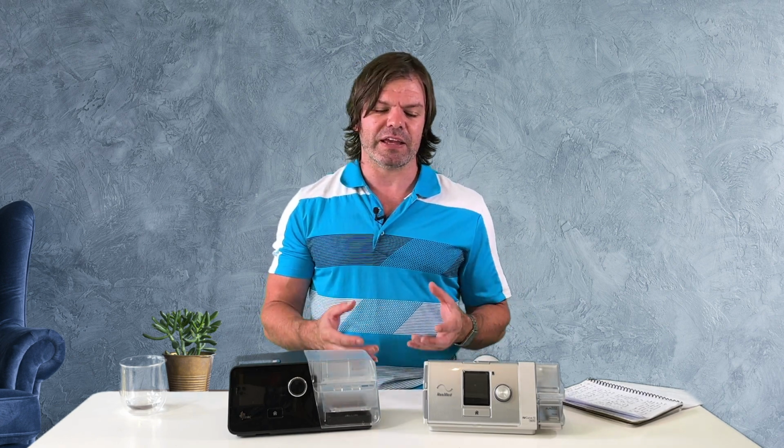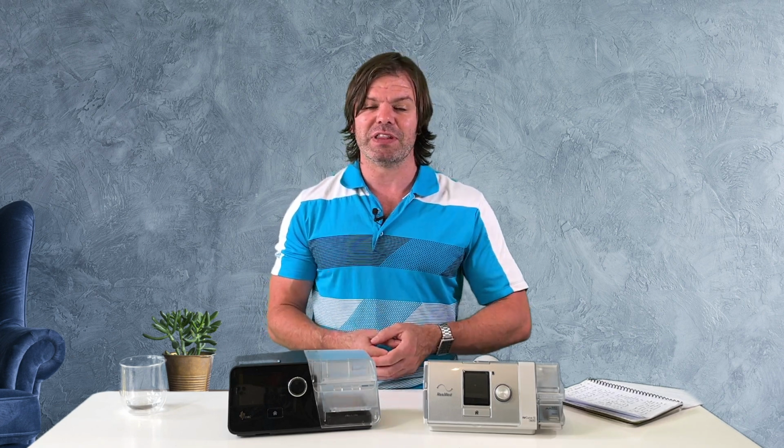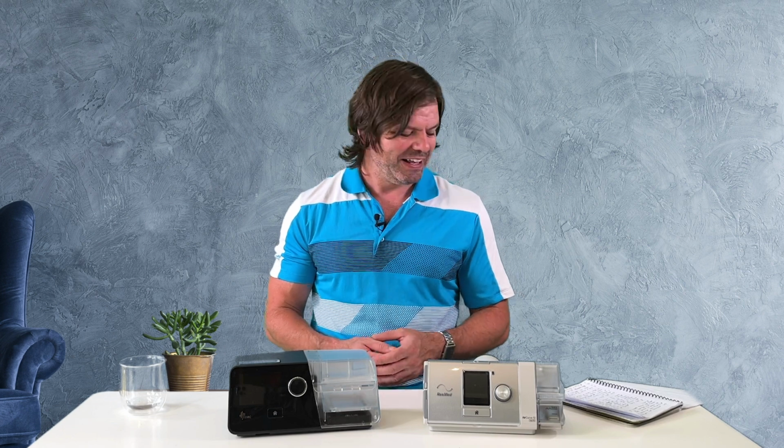Don't get too consumed by the data. It's not the be all end all. Some people just look at it each day and every day. It's something you want to look at probably once a month, and then you can just use it as a bit of a guide to see how your therapy's going. But by all means, if you're loving it, that's fine as well.